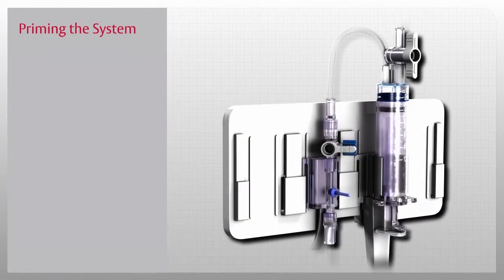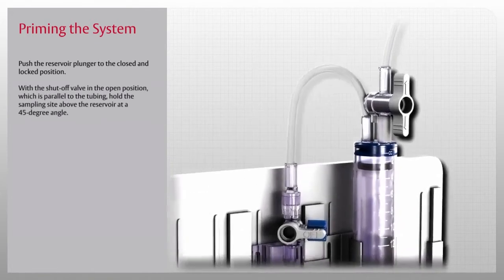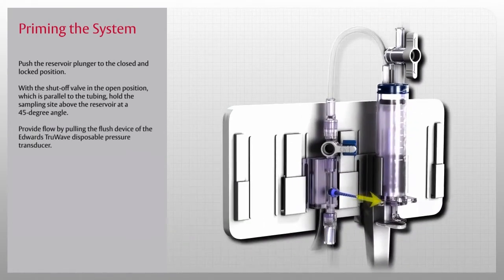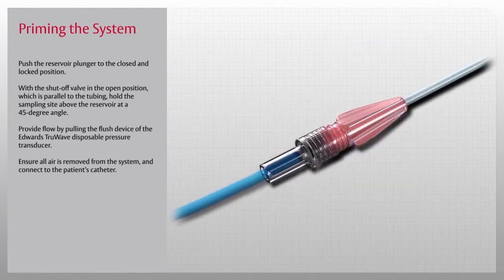Now let's learn how to prime and use this system. Push the reservoir plunger to the closed and locked position — you will hear an audible click when it is in place. With the shutoff valve in the open position, parallel to the tubing, hold the sampling site above the reservoir at a 45-degree angle. Provide flow by pulling the flush device of the Edwards TruWave disposable pressure transducer, slowly fill and debubble the reservoir at each sample site in succession. When done, ensure all air is removed from the system, then connect to the patient's catheter.